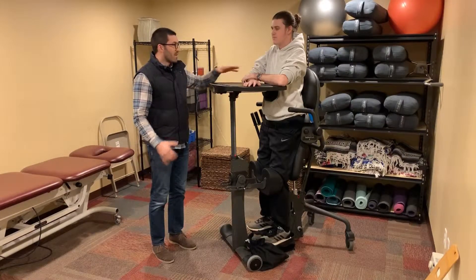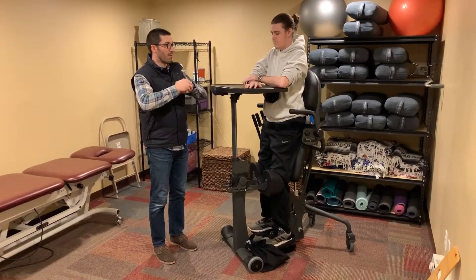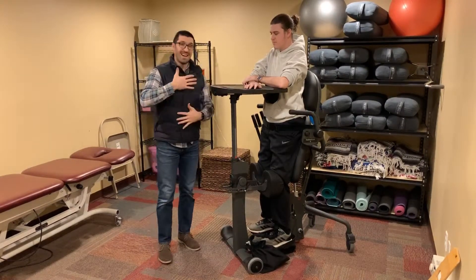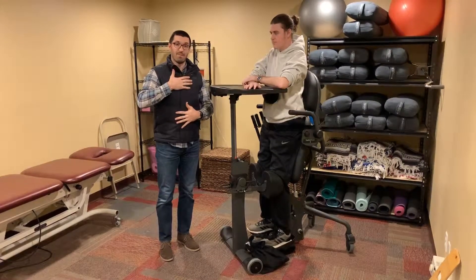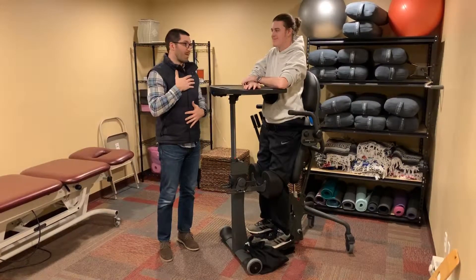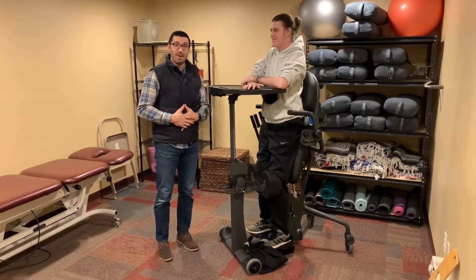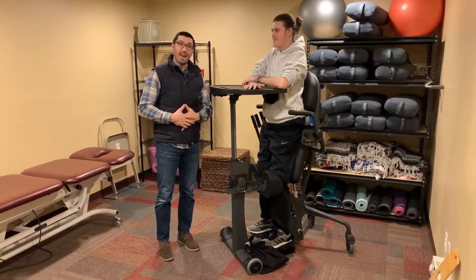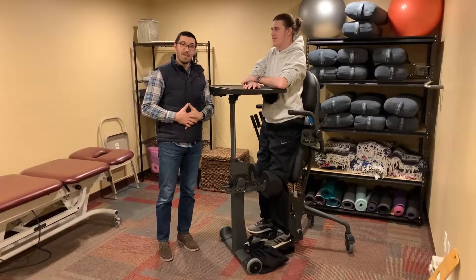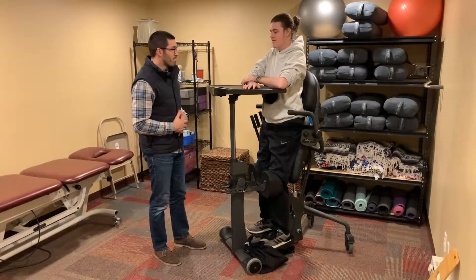Trev is able to stabilize himself with his elbows. You'll notice that this tray table is not providing a counterforce up at his sternum like you might think — it's actually down on his stomach. We do that to provide a little bit of static compression to the abdomen in addition to the dynamic compression from his abdominal binder.